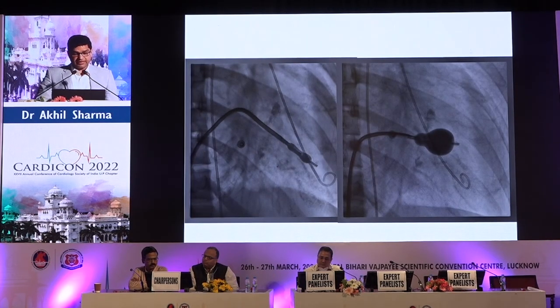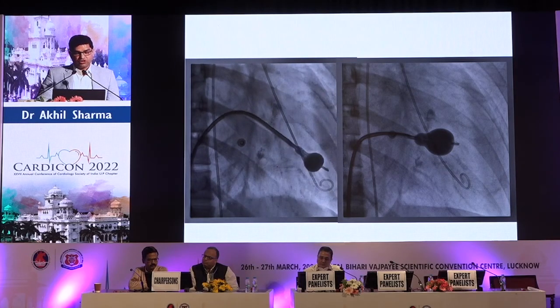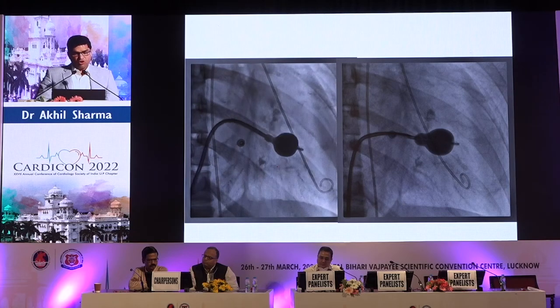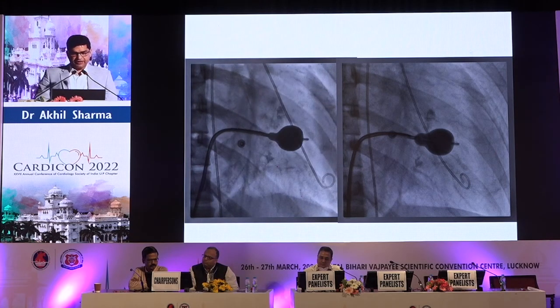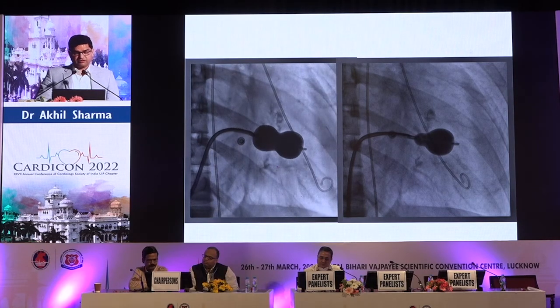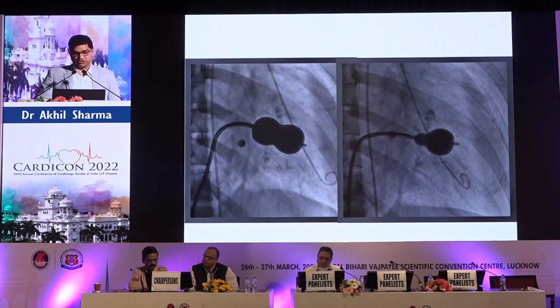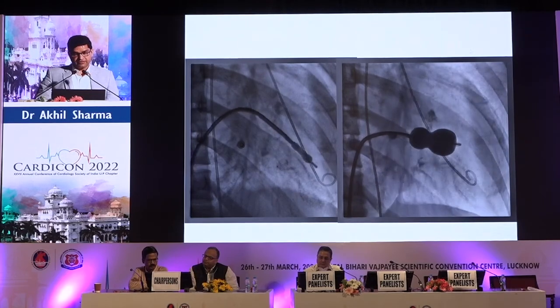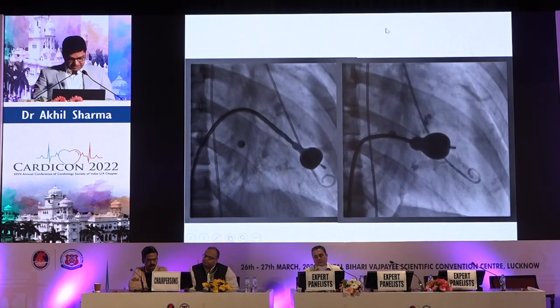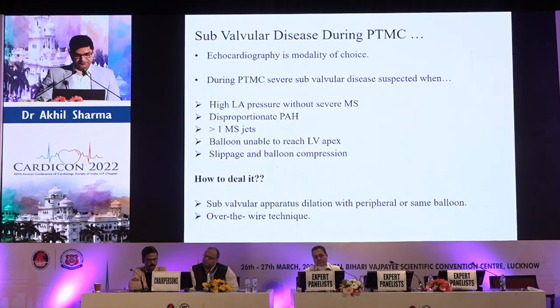And this is the case where we did it. Definitely it looks like MAC, or mitral annular calcification, with huge calcium all over the annulus and leaflets. The patient, 34 years old, presented with failure, took 3 or 4 days to stabilize, and we did gradual dilation and had a wonderful result. We have been following the patient for the last 3 years, and she is doing well.